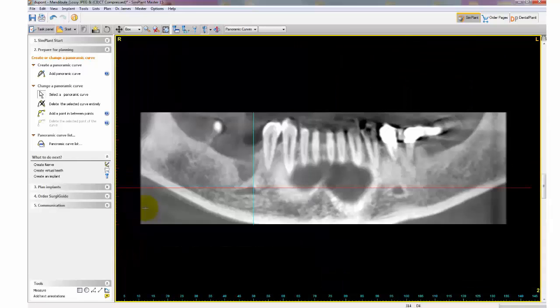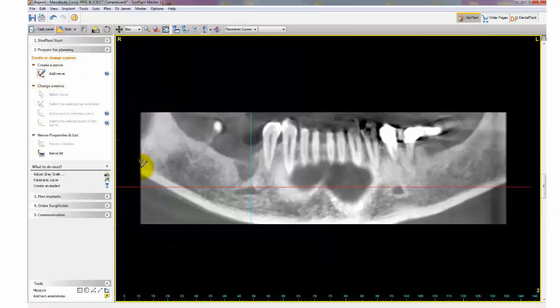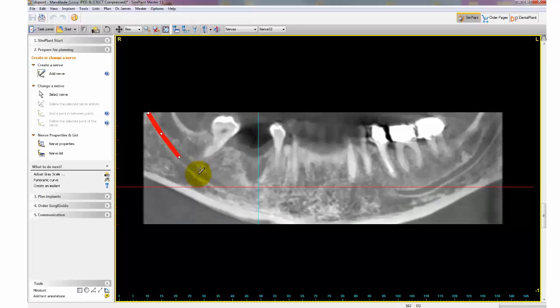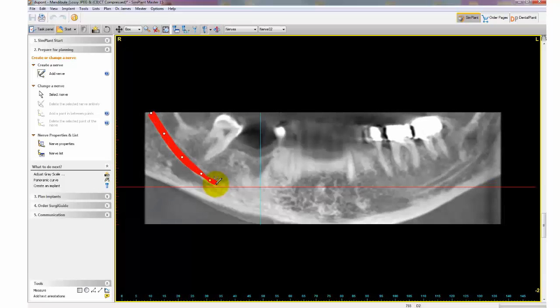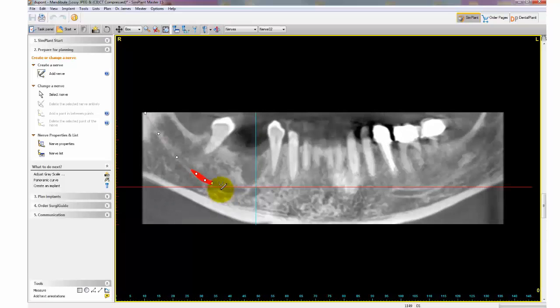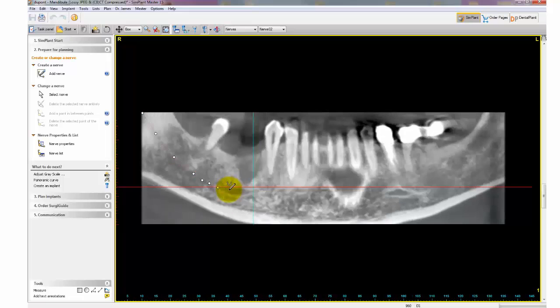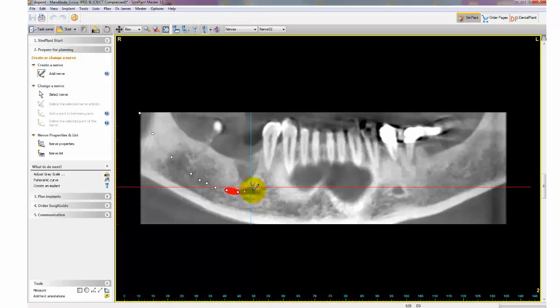Select the panoramic view, zoom in, and click NERV under the Prepare for Planning menu. Scroll through your image slices so that the nerve canal is visible and click on each nerve point. Continue to scroll and make as many points as you need. When you reach the blue line, which is the cross-sectional location of the mental foramen, stop at that specific point.